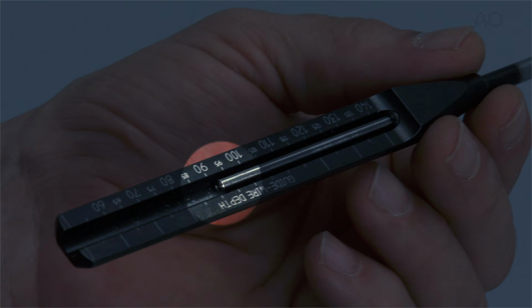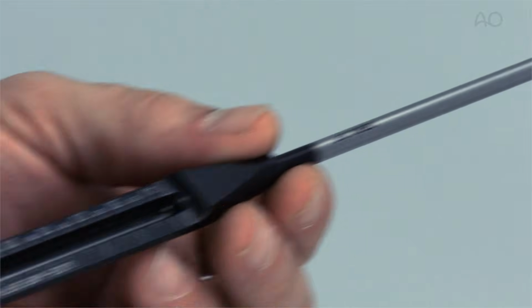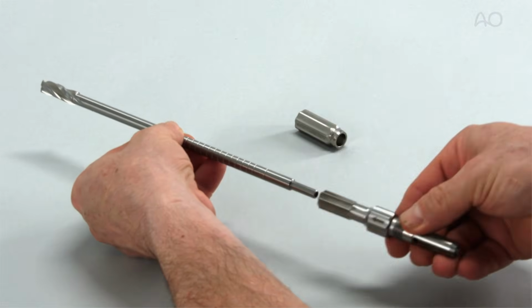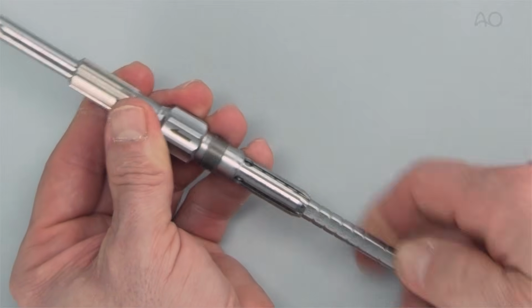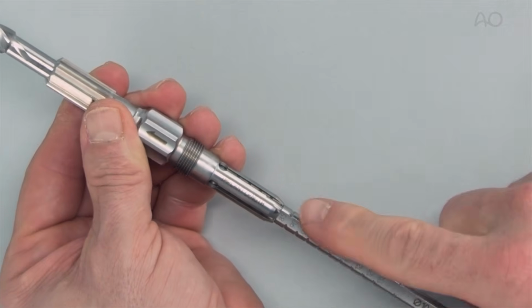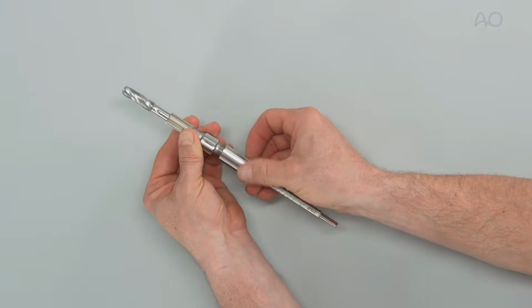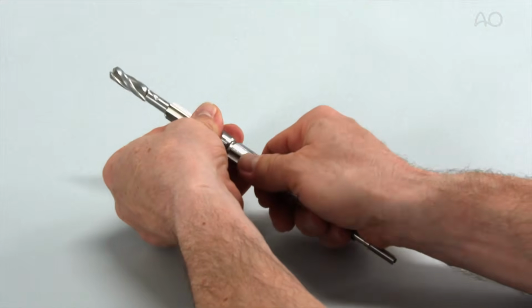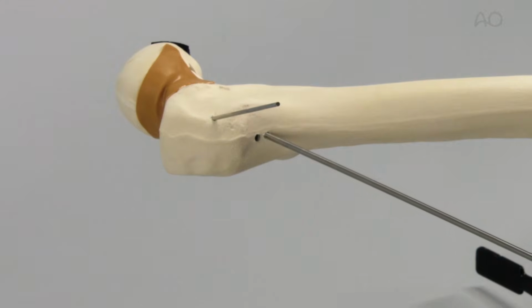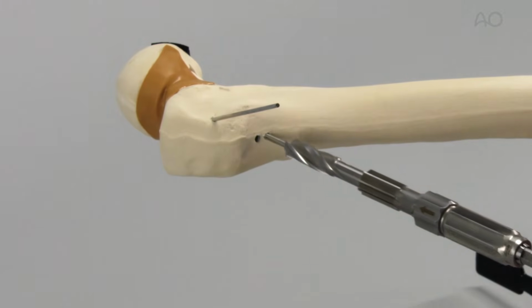5 mm are then subtracted from 92, equaling 87 mm, and rounded down to equal the reaming depth of 85 mm. The reamer is passed over the drill bit until it clicks into place and is set to the required length of the implant, which is 85 mm. The nut is passed over the drill bit, and the reamer is secured by threading the nut until hand tight. The assembly is passed over the central guide wire.